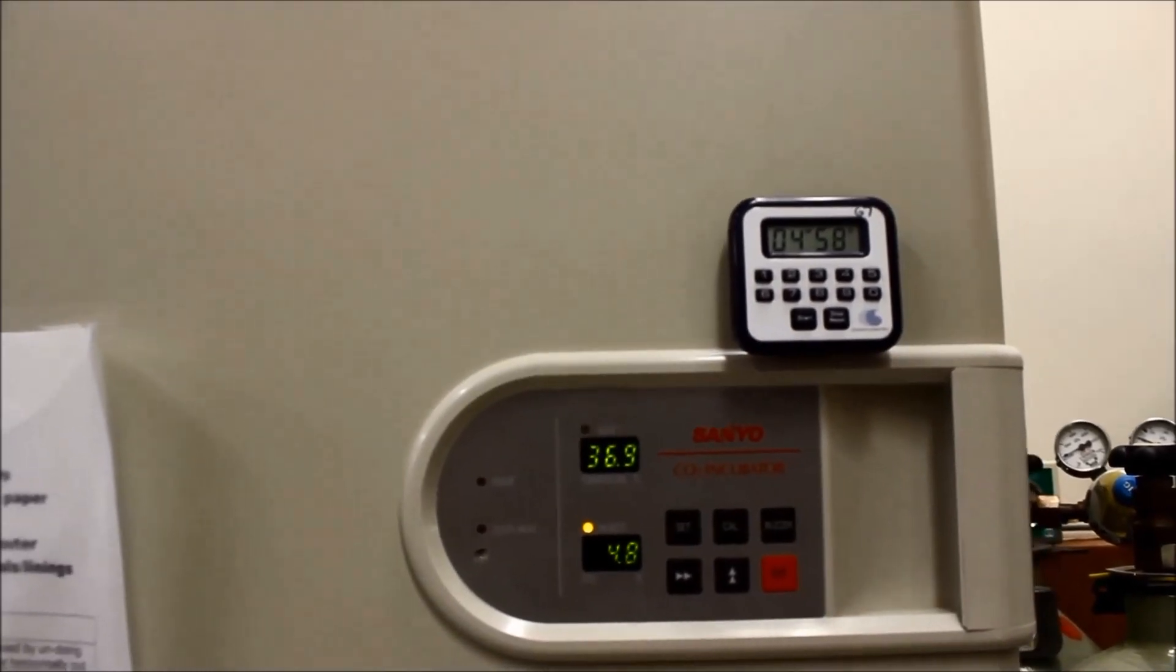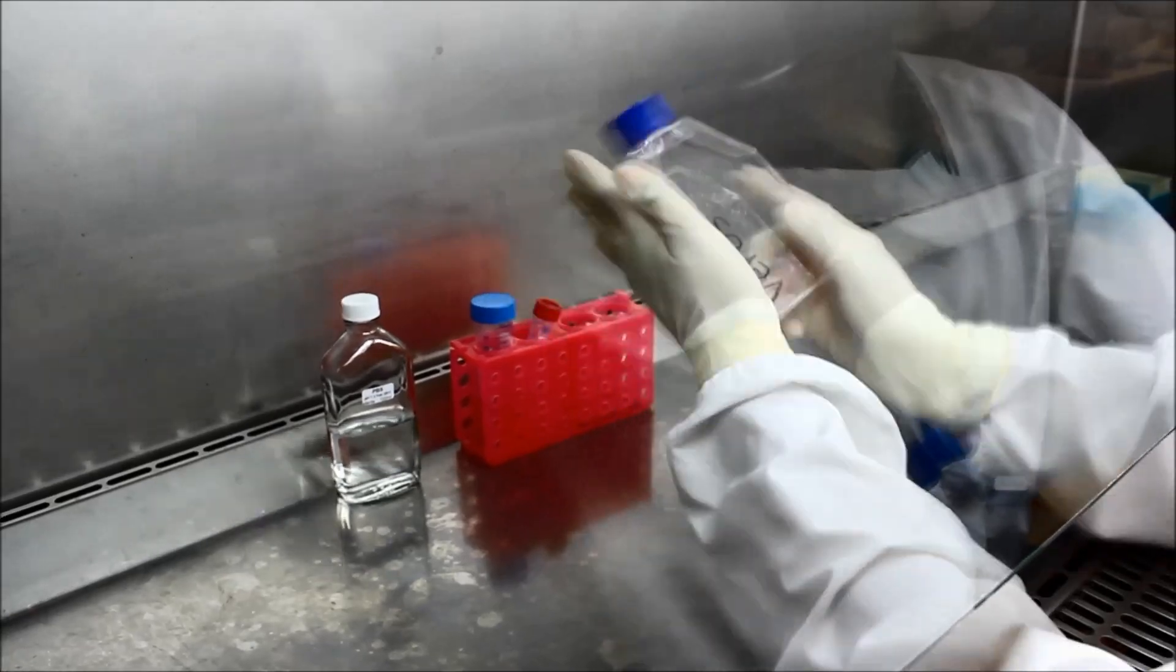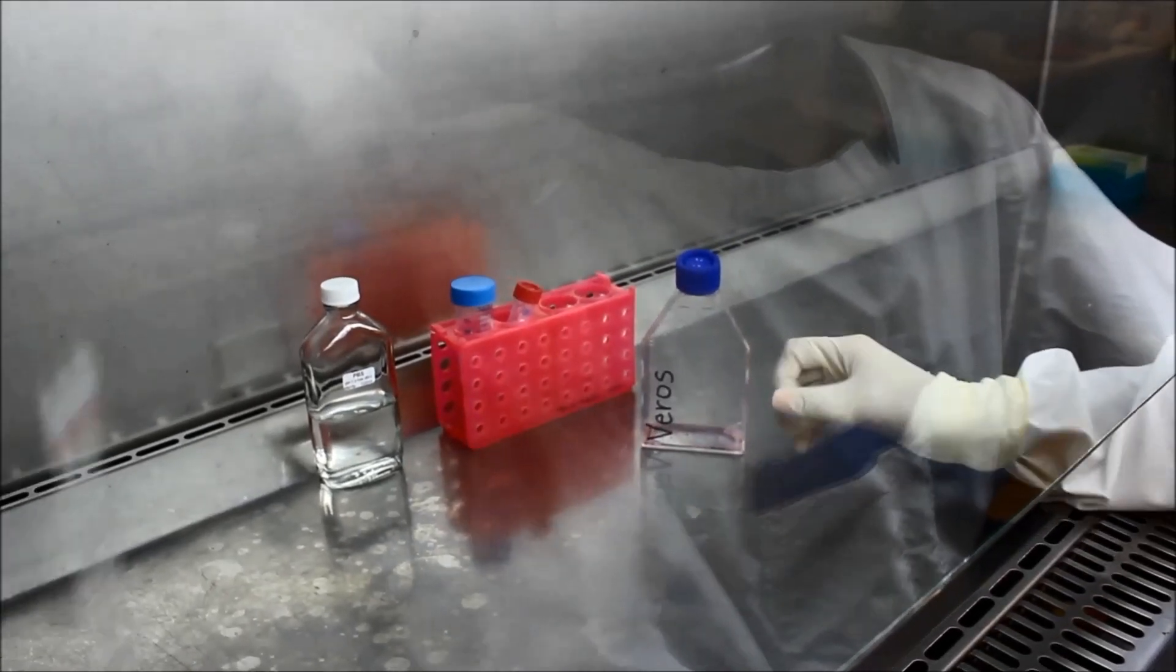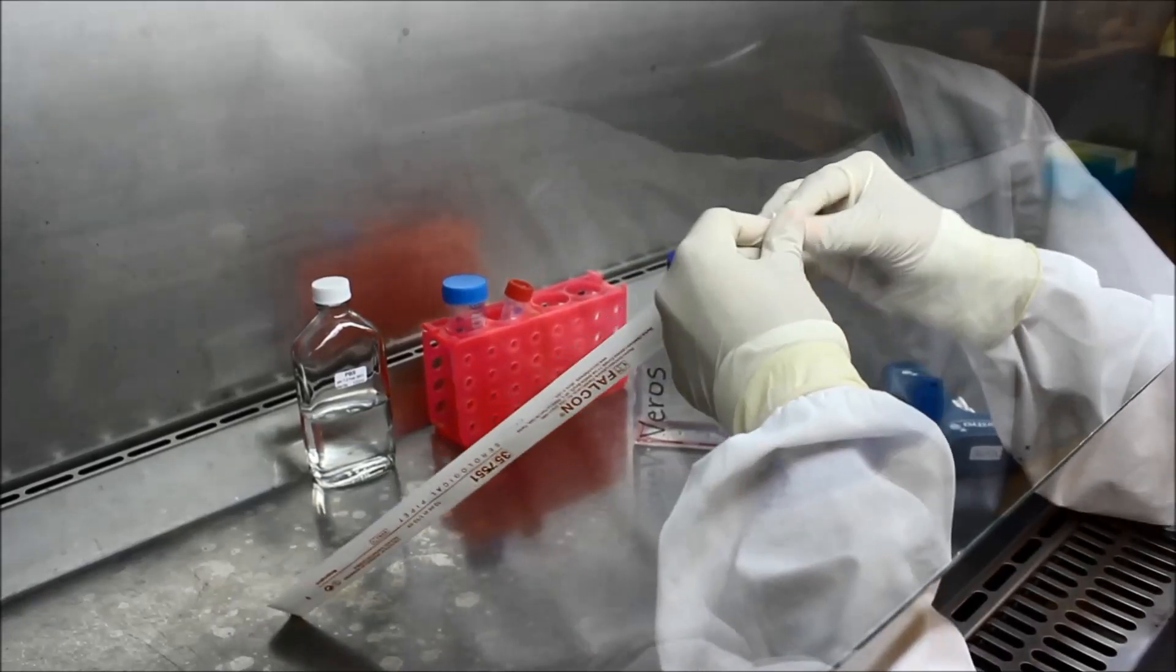Dislodge the cells from the base of the flask by holding the flask with one hand and tapping firmly with the other. If you hold the flask up to the light, you should be able to see a milky appearance with the detached cells streaming down. These are ready for resuspension.